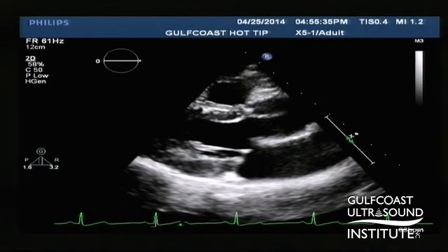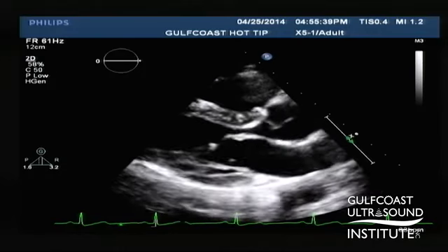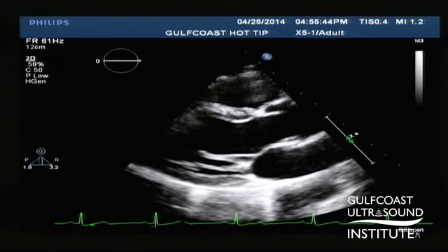The first thing we need to do to calculate an aortic valve area is to obtain a parasternal long axis view and cine loop to get to early to mid systole when the aortic valve is at its maximum opening. We then need to do a diameter of the LVOT measurement. We do this measurement right before the opening of the cusps, and we need to make sure that we enter it into our system so later on when we go to do our velocities in apical 5 chamber, the number's there.